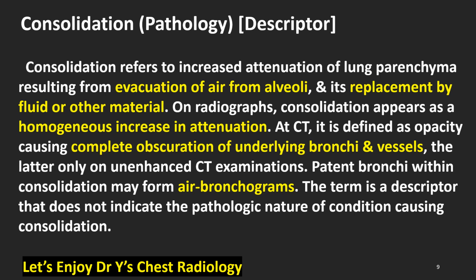At CT, it is defined as opacity causing complete obscuration of underlying bronchi and vessels, the latter only on unenhanced CT examinations. Patent bronchi within consolidation may form air bronchograms. The term is a descriptor that does not indicate the pathologic nature of the condition causing consolidation.